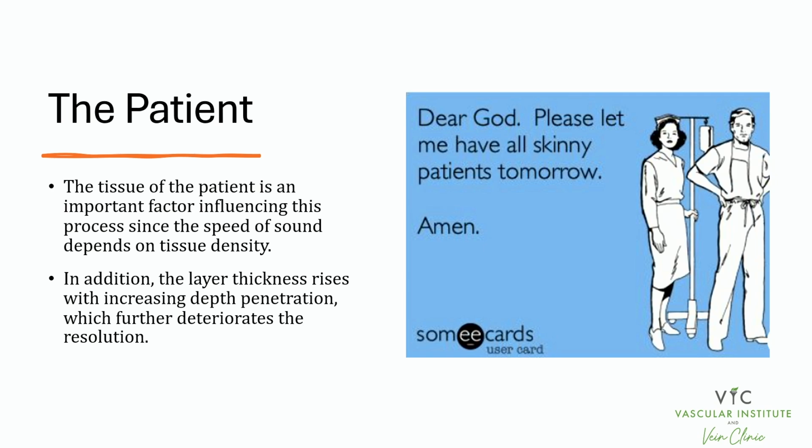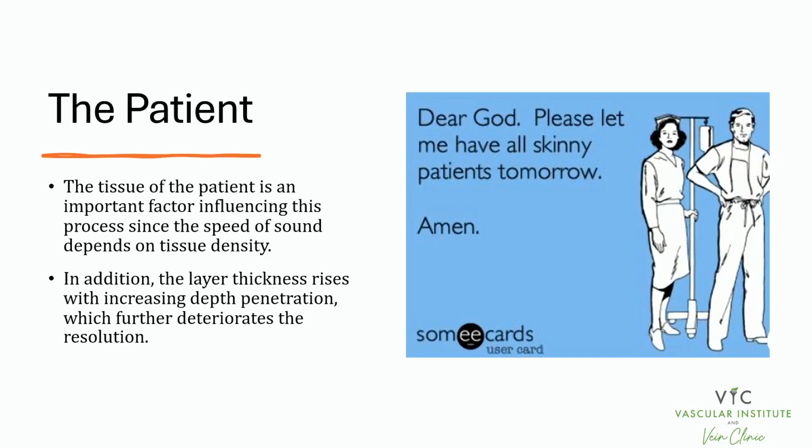So at the end of the day, this is every sonographer's creed. Dear God, please let me have all skinny patients tomorrow. Because if you've done everything you can to optimize that image, at the end of the day, the tissue of the patient is an important factor influencing the process. So if you don't get a good image, you can always blame it on the patient. It was their fault, doc. I couldn't see anything.